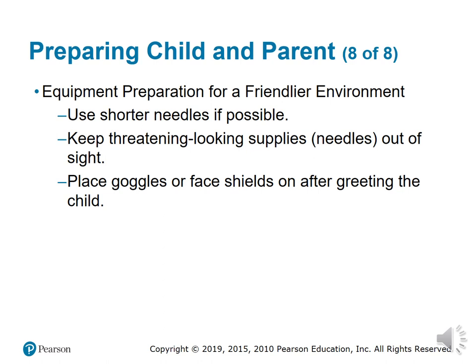We try to turn our back to where the patient, the child, can't see us, but the parent can still see us. Say it is sterile, safe, sanitized equipment that is brand new, that we just took out just now. We just don't let the child see.